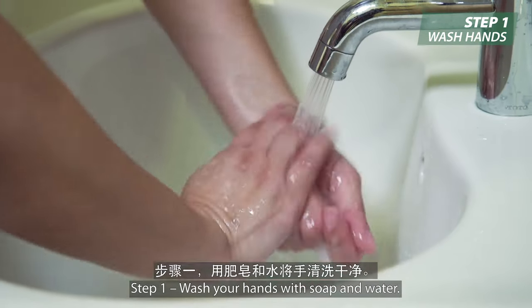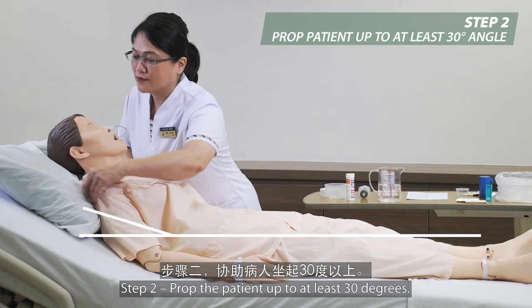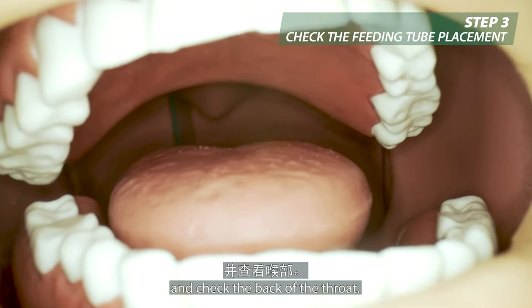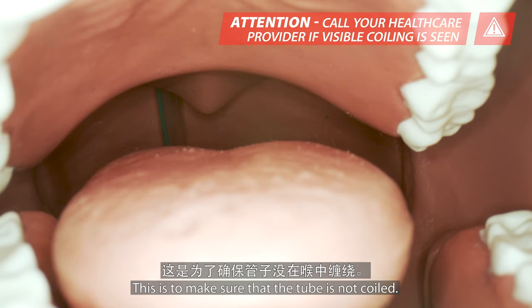Step 1: Wash your hands with soap and water. Step 2: Prop the patient up to at least 30 degrees. Step 3: Ask the patient to open his mouth and check the back of the throat. This is to make sure that the tube is not coiled.